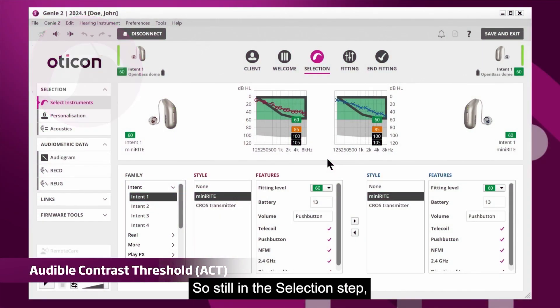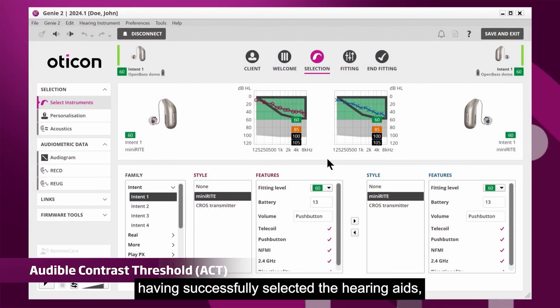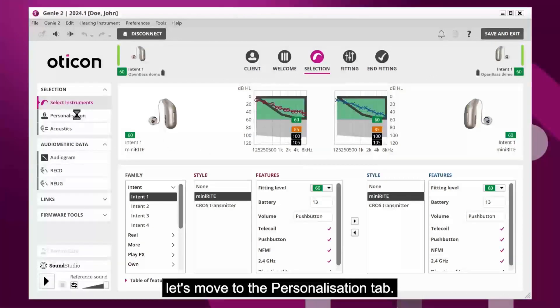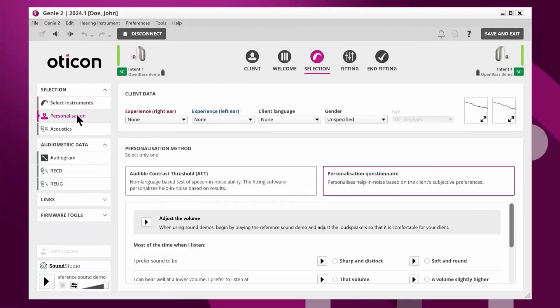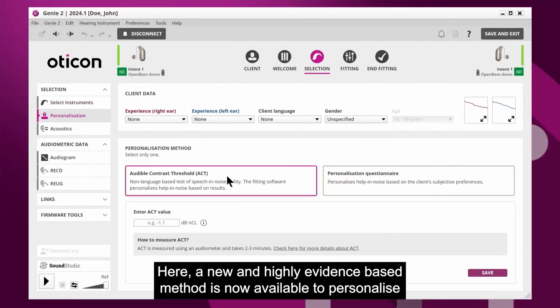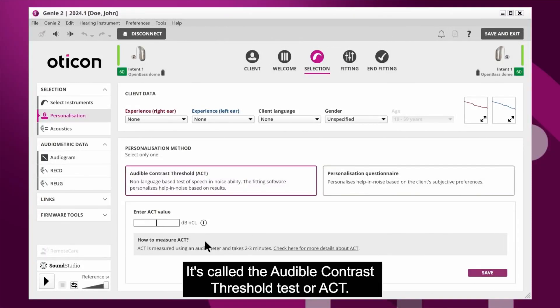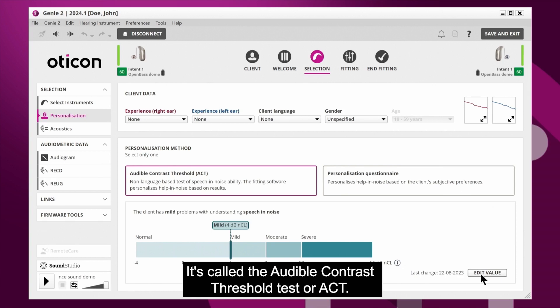Still in the selection step, having successfully selected the hearing aids, let's move to the personalisation tab. Here, a new and highly evidence-based method is now available to personalise your fitting based upon the client's individual hearing and noise ability. It's called the Audible Contrast Threshold Test, or ACT.